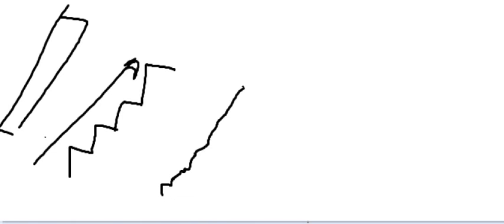So the thinner you make your reconstruction, the better and smoother the reconstruction you'll have. And nowadays we are very close to what's called isotropic voxel, that is, every pixel or voxel has equal dimensions. For example, 1 millimeter height, 1 millimeter width, 1 millimeter length. That will help you make a reconstruction without artifact, just like the original one.